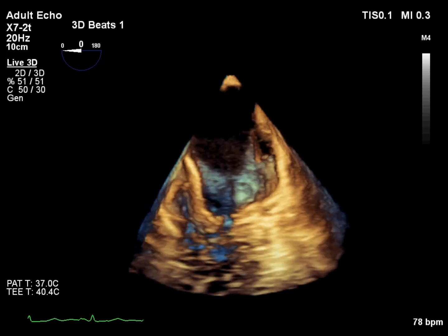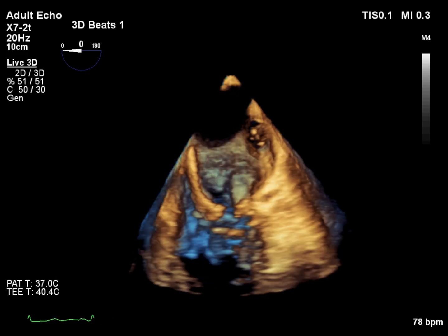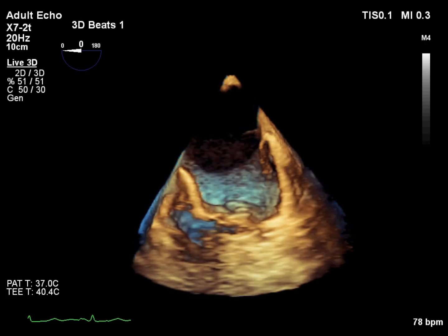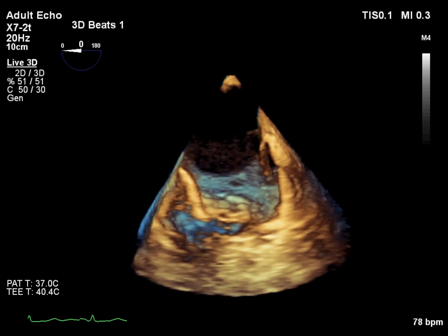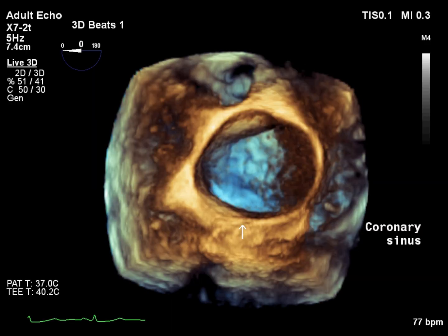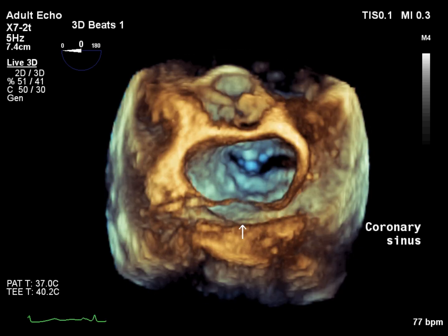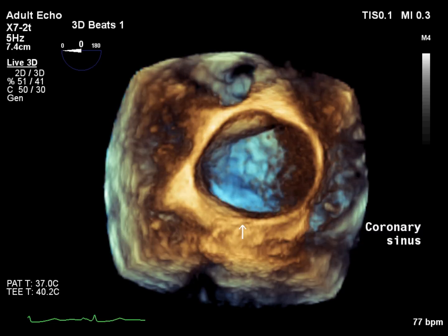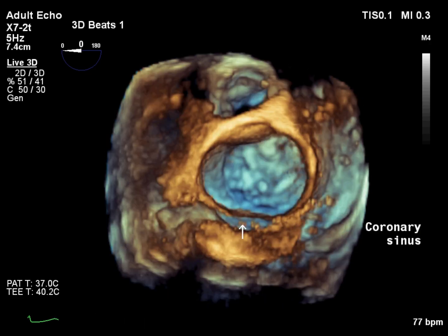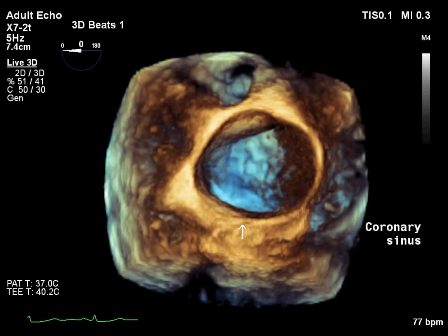This anomaly is most commonly associated with a persistent left SVC, although it can also be part of more complex congenital heart defects. In this 3D echocardiographic view, the aortic valve is seen at the top, the mitral valve annulus in the middle, and the dilated coronary sinus located posterior to the mitral valve.